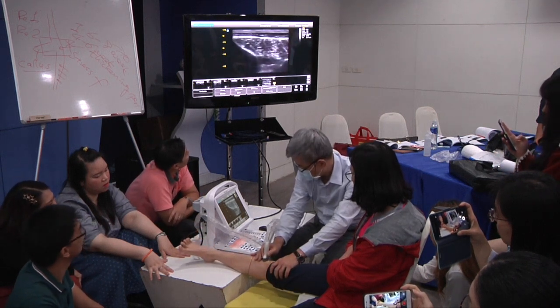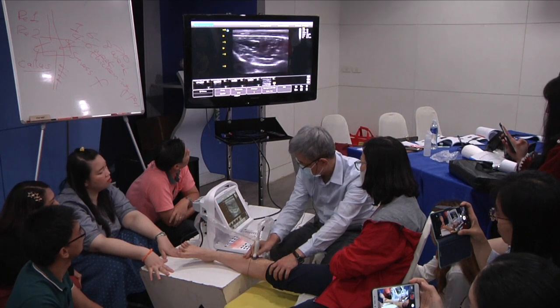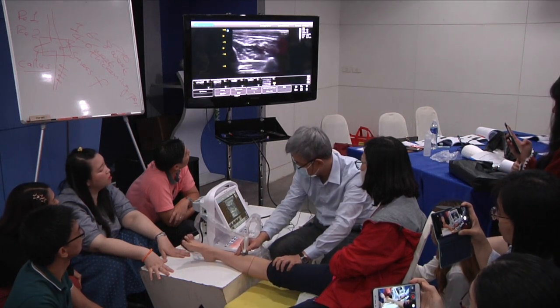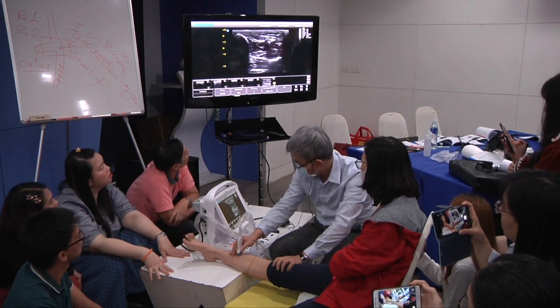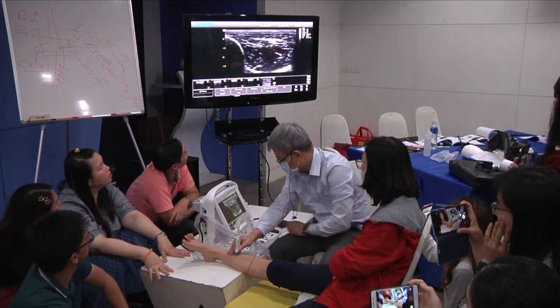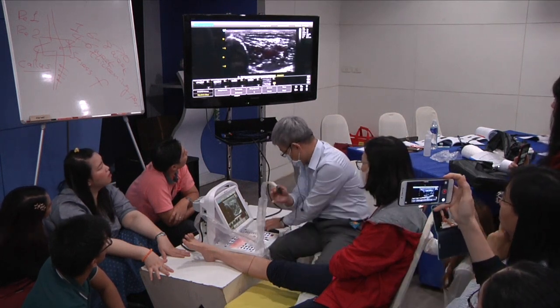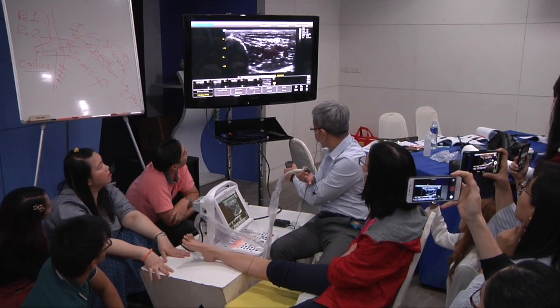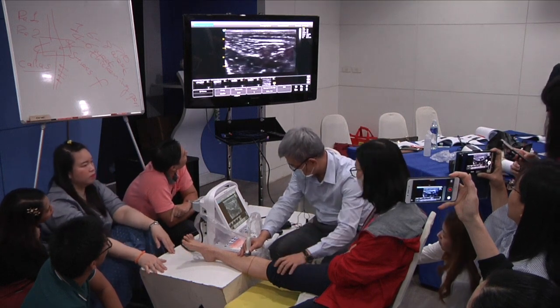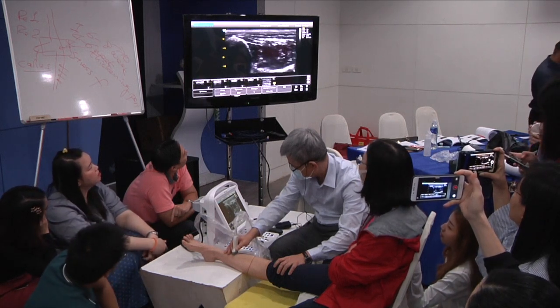Okay, I think because we have a lot of people here today, we just practice the tibialis anterior. Okay, turn 90 degrees. Practice, turn 90 degrees. Then, okay, tibialis anterior, go. Then our beloved tibialis anterior tendon is coming. Okay, good. See? Two little kids become one. This is not so bad, really. It's still very good in my hands. Two little kids become one. Ladies, gentlemen, tibialis anterior tendons.